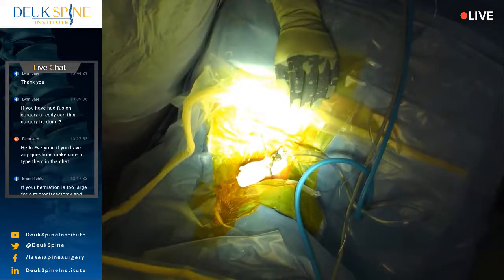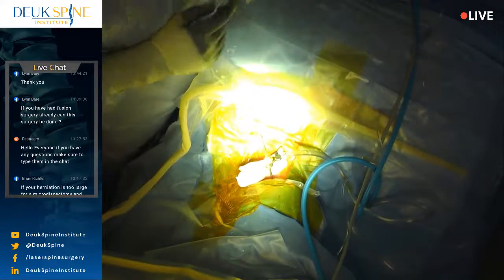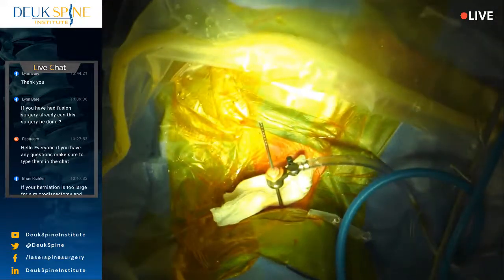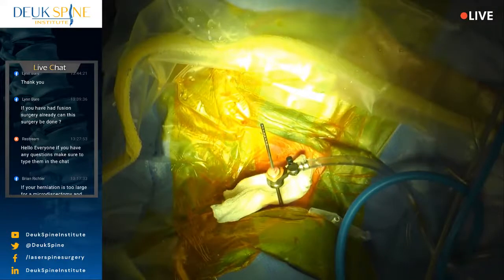Look at me, doctor. So kind of pulling straight back, but slight extension. Give me a countdown. 3, 2, 1. Yeah, get in here, Jordan.